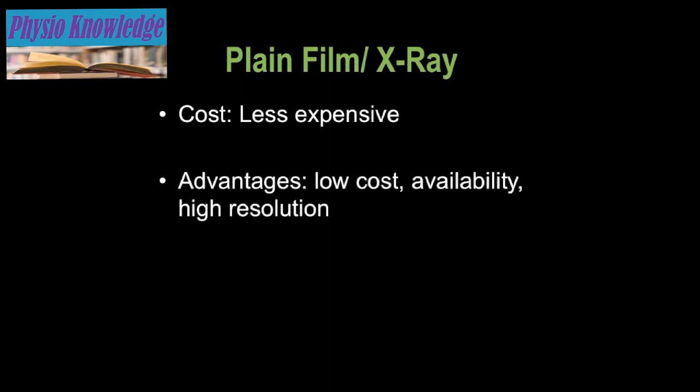So, talking about plain films or X-rays, we really know that the cost is much less expensive than any other imaging modality out there. So that's an advantage. It's highly available and it has high resolution. Actually, it has a higher resolution than CT and MRI.